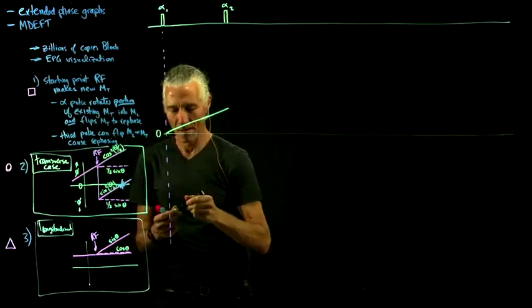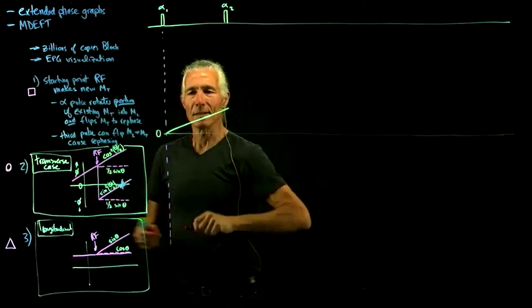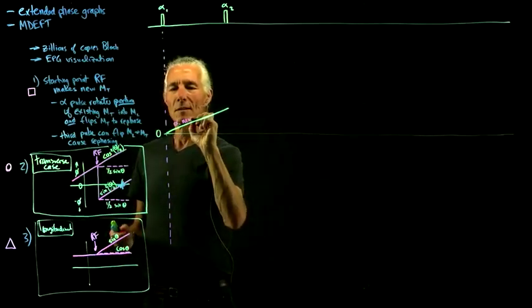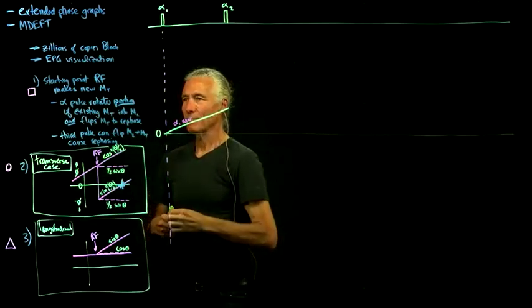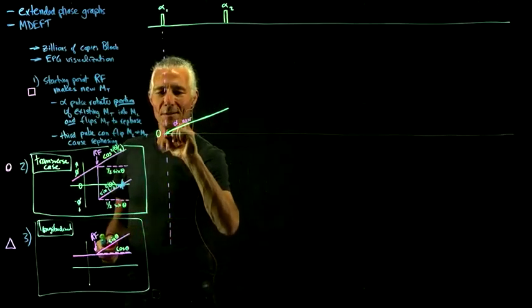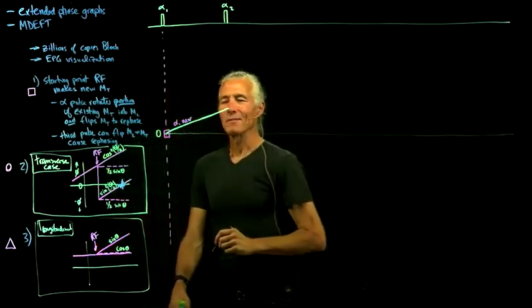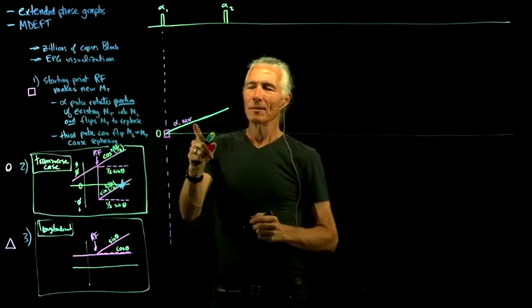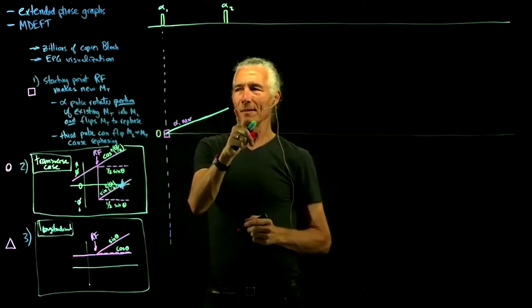And that's all that happens. So this is alpha 1 new, and that guy is a square. So we just sort of started generating some transverse magnetization that starts to dephase.